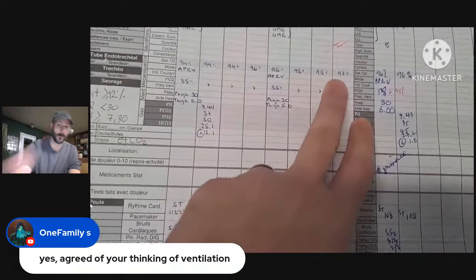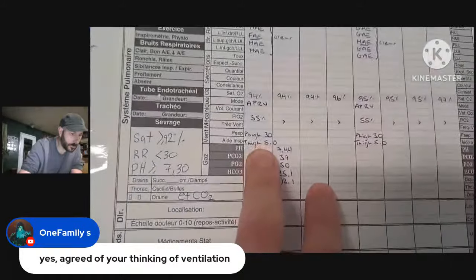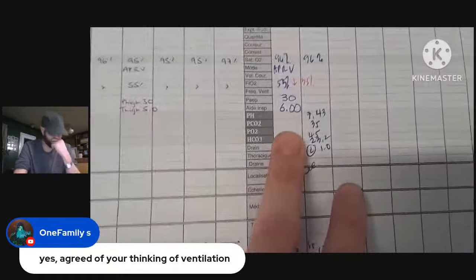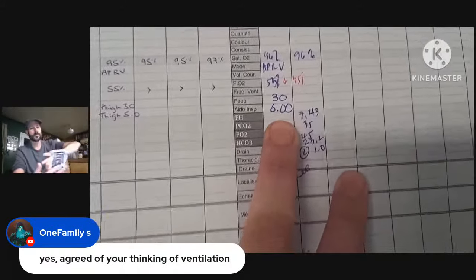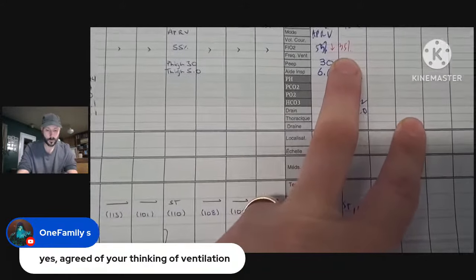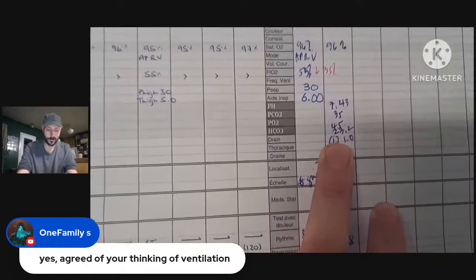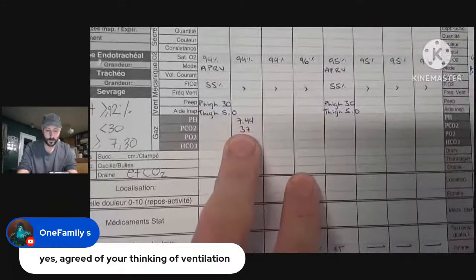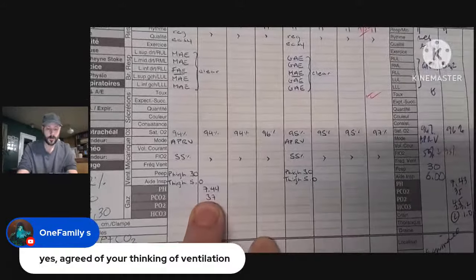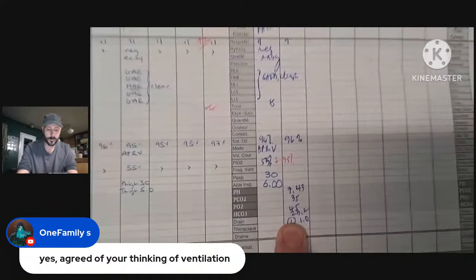There you go. 95, maybe 95% sats. So they had stretched it to 5 seconds. There was a normal blood gas here on 5 seconds. So I immediately stretched the patient to 6 seconds, kept the 30. And we've been able to wean the FiO2 to 35% now. And the blood gas is even better. So we had 37 for CO2 with 11 releases. And then we extended, and now we're down to 9 releases, and we have an even better blood gas.